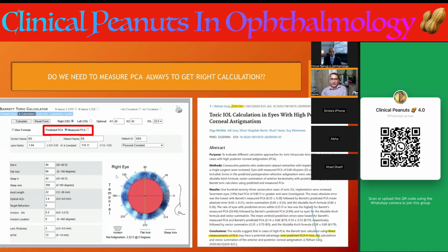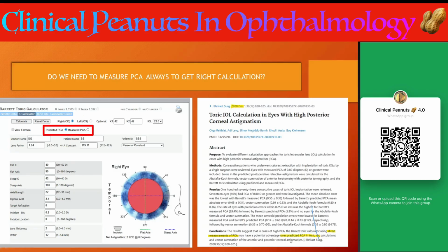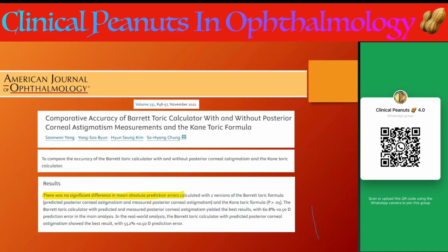And if you are having the latest instrumentation, you can use the measured PCA also. In IOL Master 700, the measured PCA can be used. This is the publication wherein they said that a slight benefit is there, or the outcome is better with the measured over the predicted. But some of the recent studies say that there is no significant difference between the absolute prediction error in between the calculated or predicted way of looking at posterior corneal astigmatism in the Barrett toric formula.